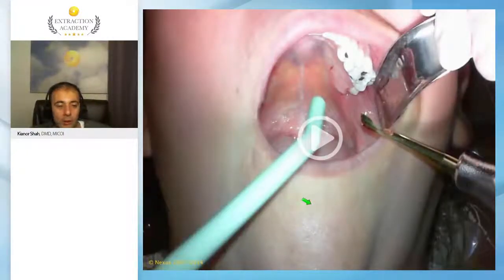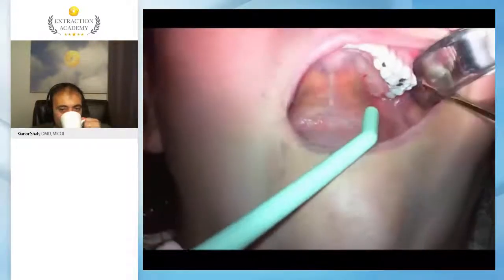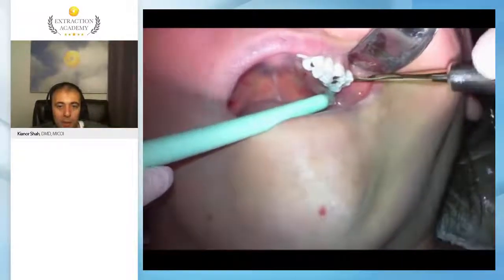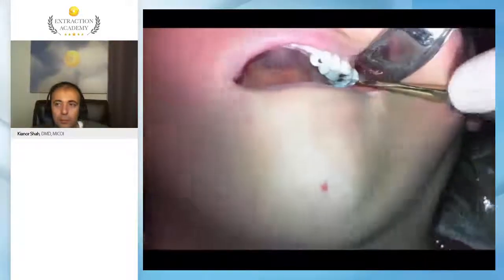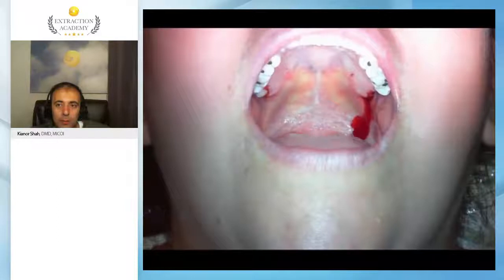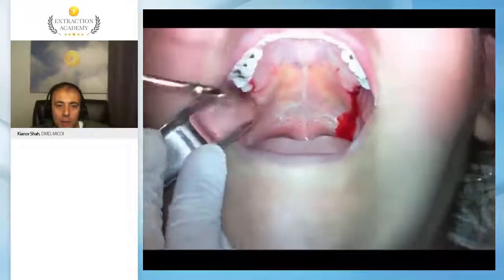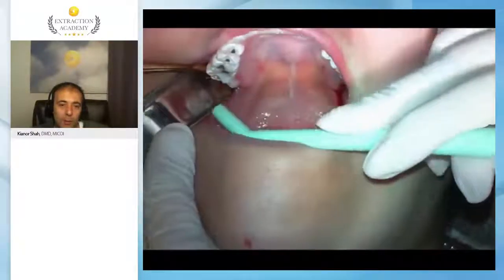So let's take a look at this video. Again, a very minute motion to be able to... Same scenario here, engaging the mesial buccal, a simple rotational movement.